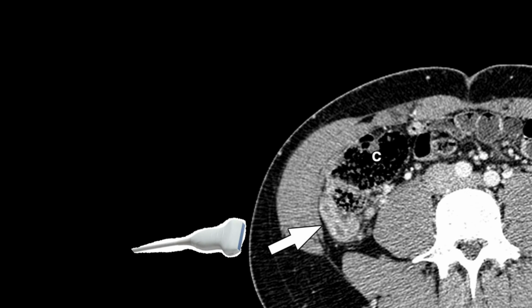We can see that scanning from this initial position would make use of the musculature as a sonographic window, as opposed to the second ultrasound probe position, whereby we're going to be scanning through the cecum with gas, causing our ultrasound beams to deflect and not be transmitted well, meaning we might miss an appendix that's positioned there.